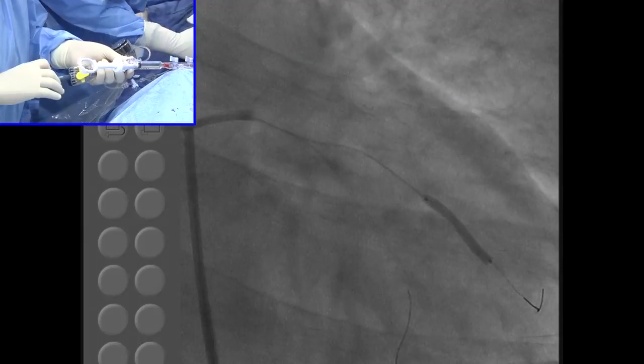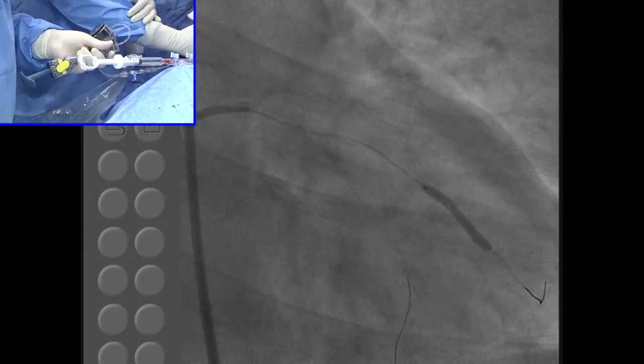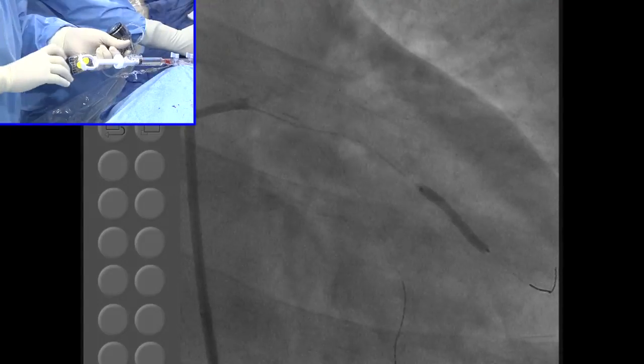Even then, 20 is too long. I wanted a 10. For what? Chocolate. No, you can do from proximal to the OM. I mean, but this is then... no, you don't want to use the same balloon in the other branch.